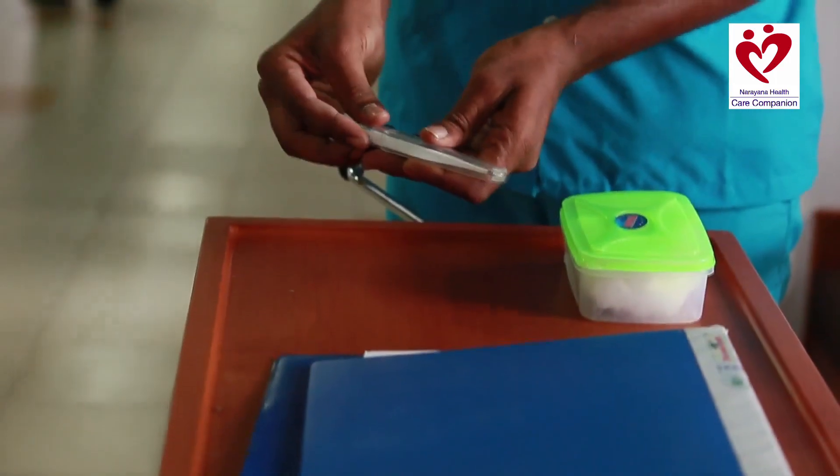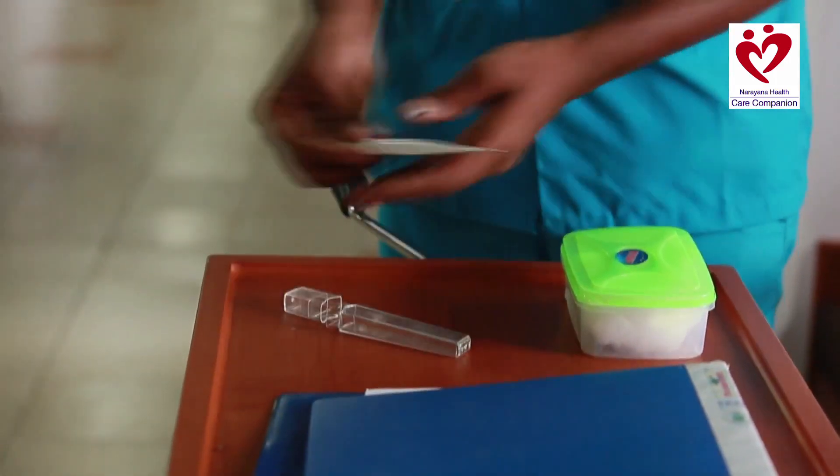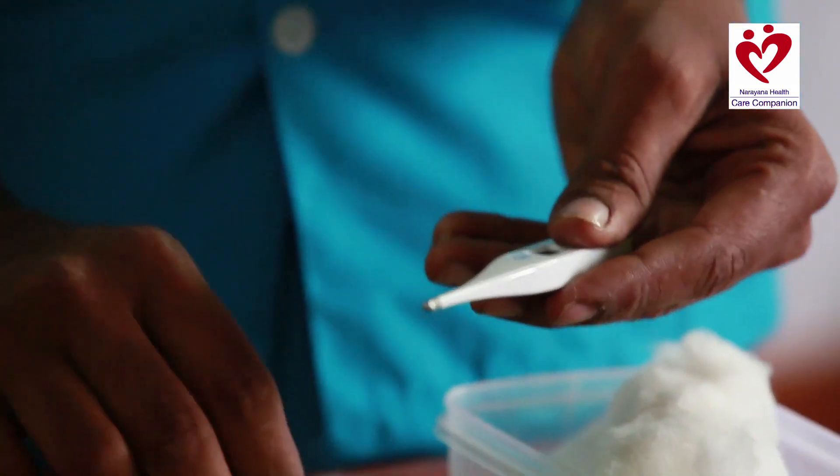To measure internal body temperature, you need a thermometer. Before taking temperature, firstly, the patient should not have eaten or drunk anything in the last 10 minutes because that will affect the temperature. Secondly, you must wash germs off the thermometer before taking temperature.